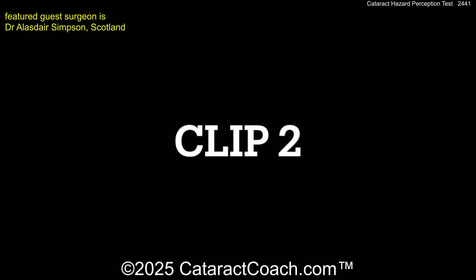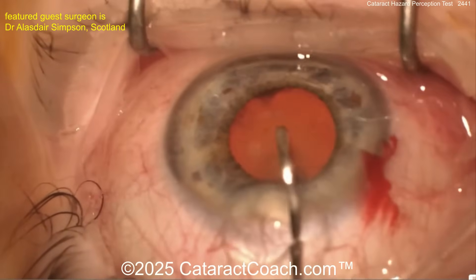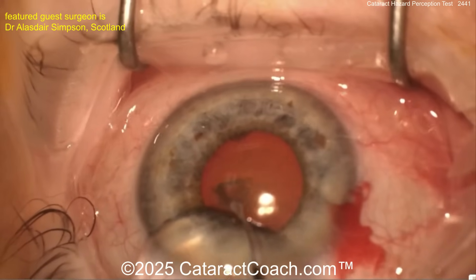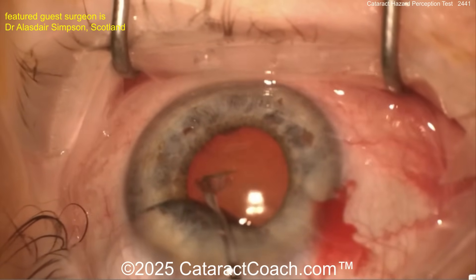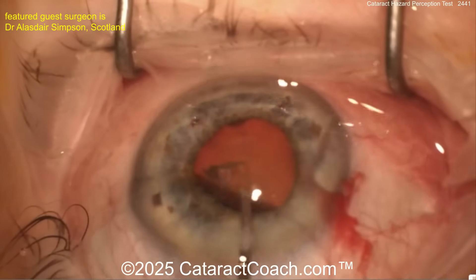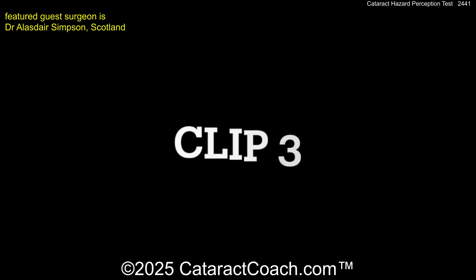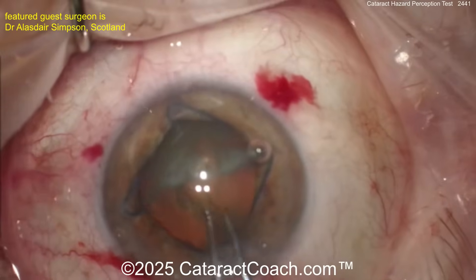Clip two — what's going on in this one? Going inside the eye, eye not in primary. Look at the AC shallowing. Look at all the viscoelastic coming out of the eye — what are we doing here? The view is very obscured, really not ideal. This is where the patient's chin is tucked. If the patient's chin is tucked, your surgery is challenging.